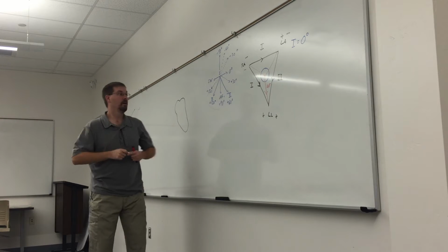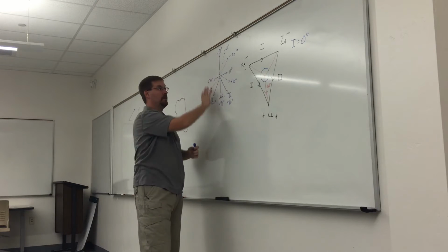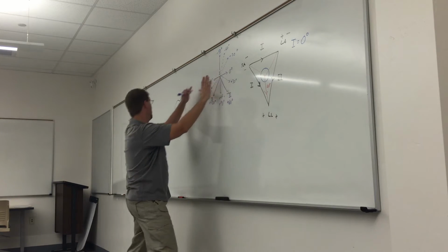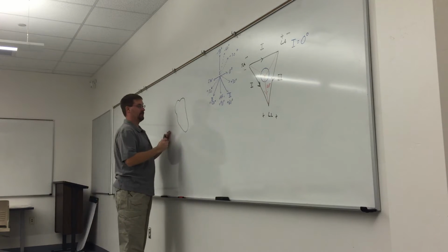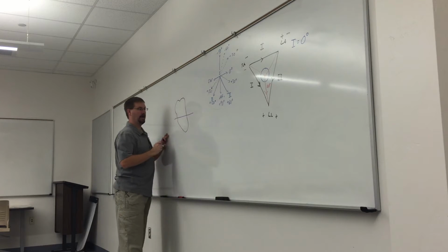No? Okay. So what I'm going to do now is I'm going to take this axis, these coordinates that we derived from Einthoven's triangle, and I'm going to put that system right on top of the heart. You guys cool with that? So imagine, if you will, that I just draw a line.